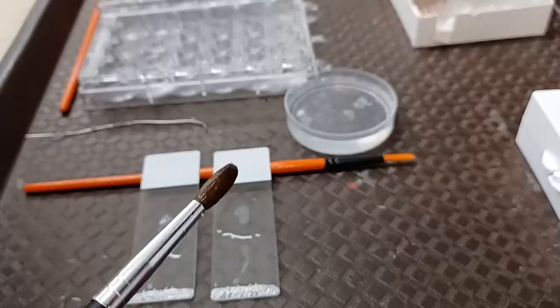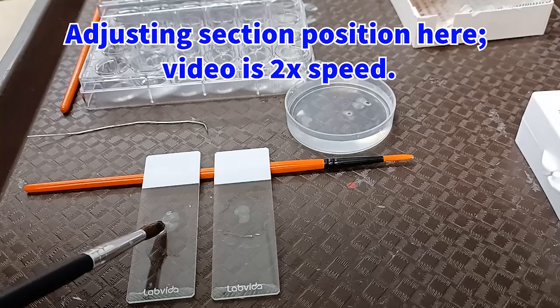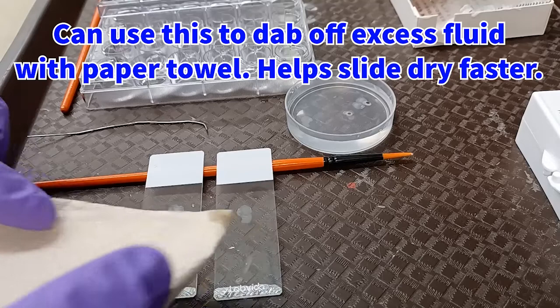Here's an example of mounting a section with conveyor belt style, where the section is on top of the brush and the brush rolls out from underneath as the section goes onto the slide. You can carefully poke at sections with the brush in order to reposition and unfold them on the slide. Having slides tilted up slightly will cause the fluid deposited on the slide to run down toward the edge of the slide, making it easier to use a paper towel to dab off the excess solution, which will then allow the slide to dry much faster.